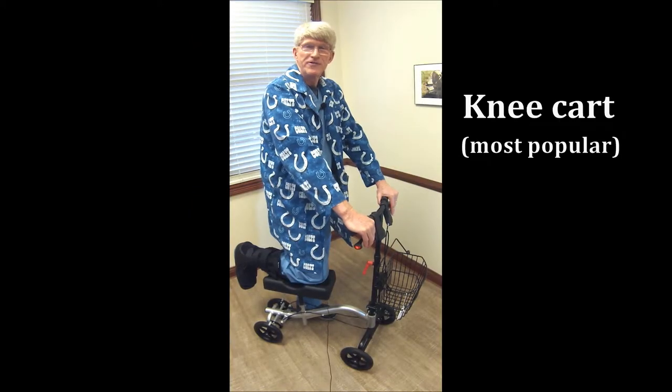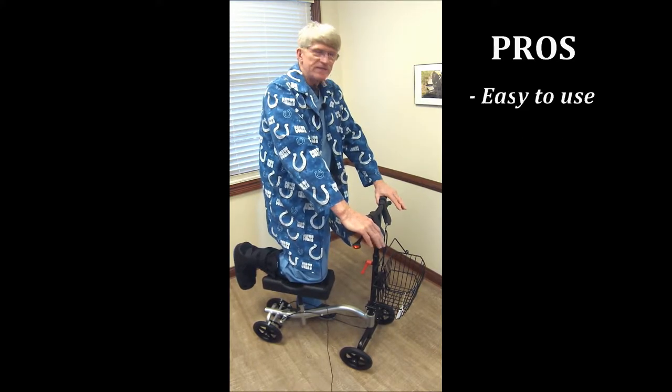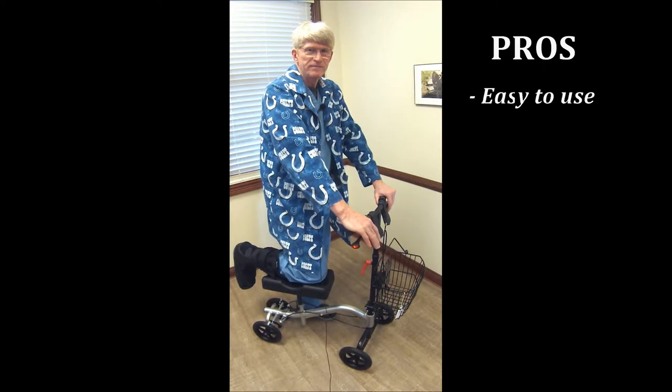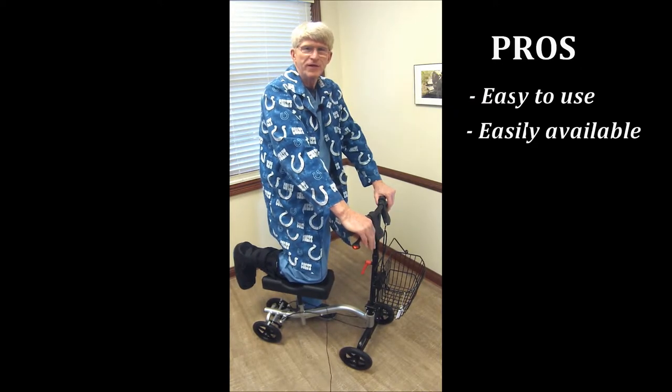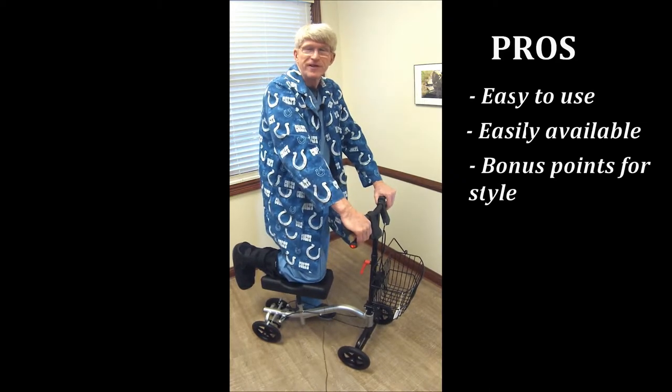Now this is the knee cart, knee stroller, kneely cart — and they're pretty popular. You see an awful lot of them around. The nice advantage of this is that the learning curve is very quick and pretty easy. They are available in many, many locations. You can bling these out with a cart or a horn, which is also nice to do. You get bonus points for stylizing these.